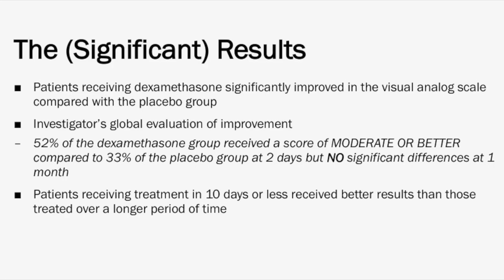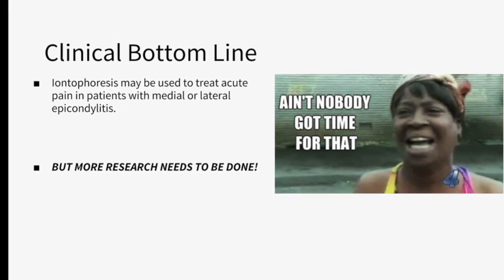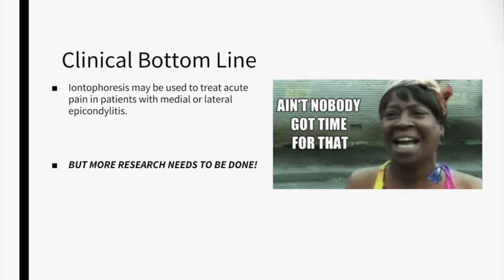So what is the clinical bottom line? Well, according to this study, iontophoresis may be used in addition to therapy to treat pain in acute medial or lateral epicondylitis, but as like most of these modalities, more research just needs to be done.